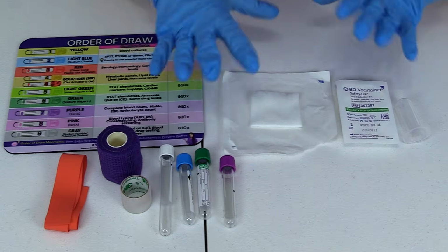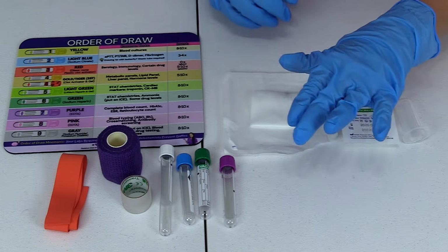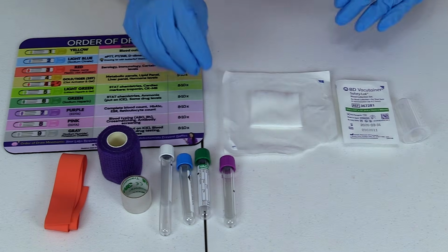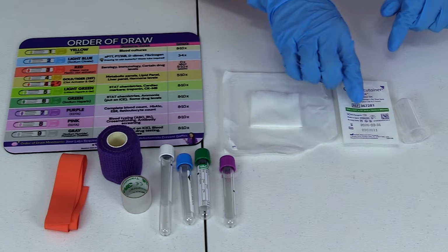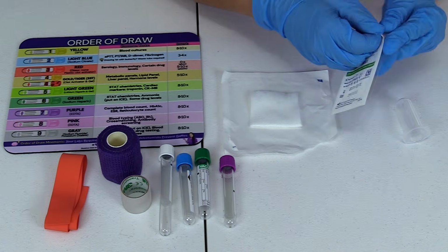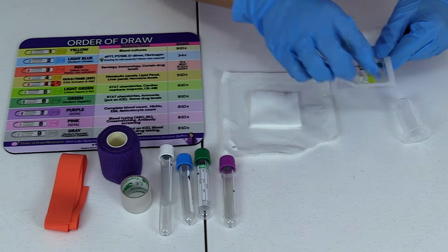To set up your supplies, you want to do it in a way that makes sense to you, because one hand is going to be very busy holding the needle so it doesn't move out of the arm, and then the other hand is going to be grabbing the supplies. So to set up your collection set, whatever you're using, I'm going to do like I did earlier. I'm going to peel this open, and I'm going to make sure everything is ready for me.